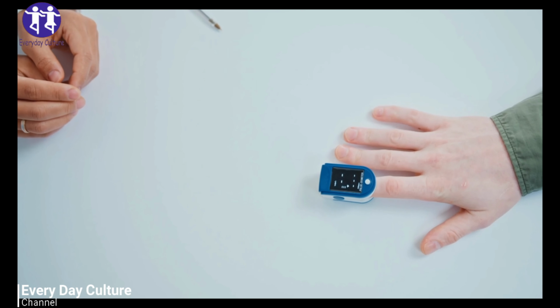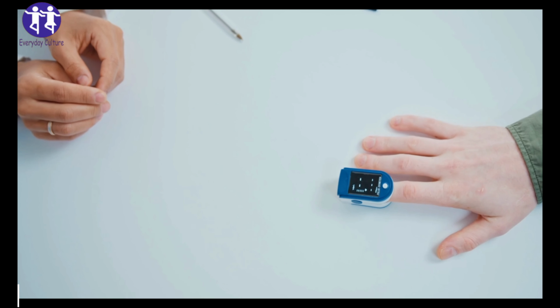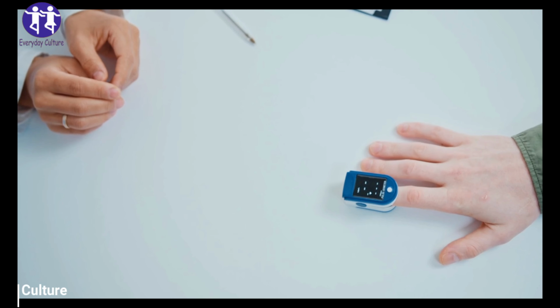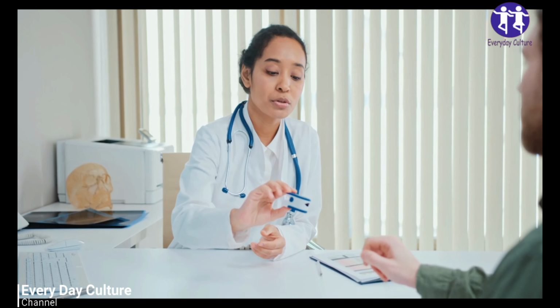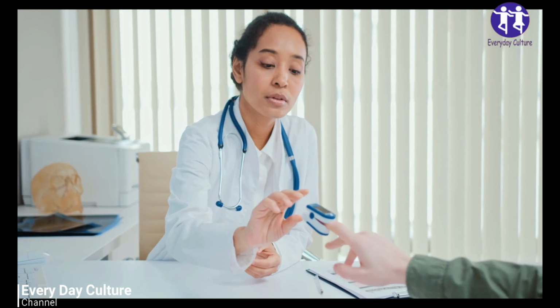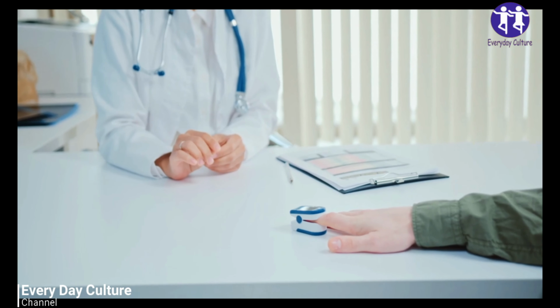When hemoglobin has oxygen bound to it, it's called oxyhemoglobin. And when there is no oxygen bound, it's called deoxyhemoglobin. Pulse oximetry is based on the principle that oxyhemoglobin and deoxyhemoglobin absorb red and near-infrared light to different extents. Oxyhemoglobin absorbs greater amounts of infrared light and lower amounts of red light than deoxyhemoglobin.